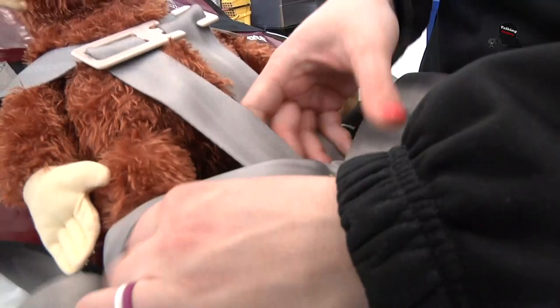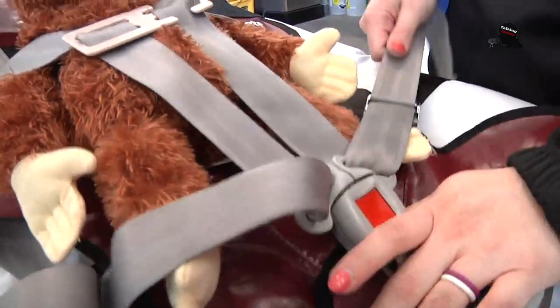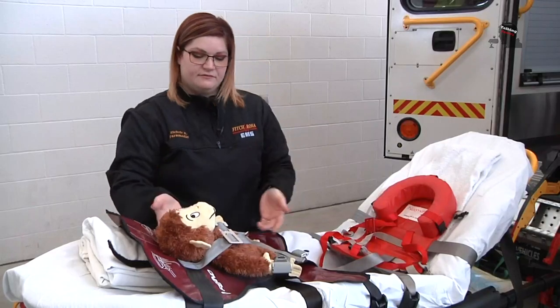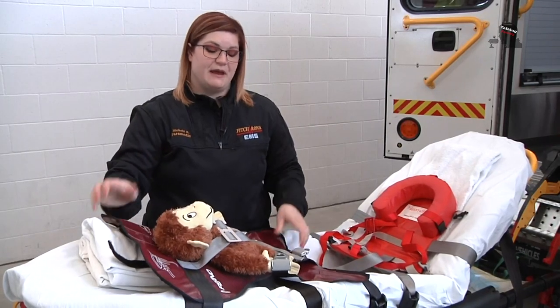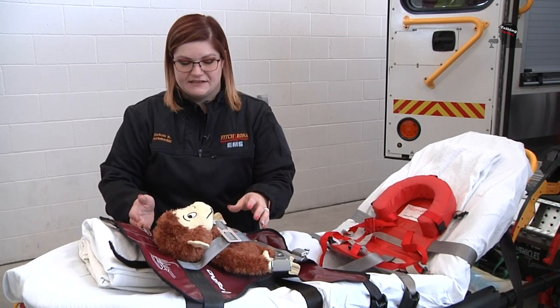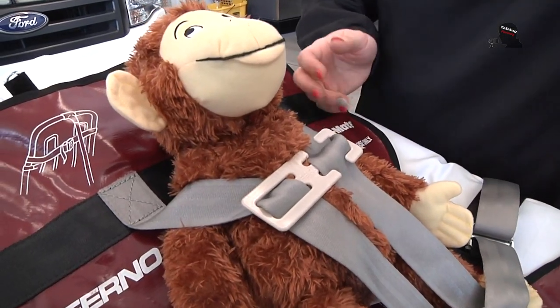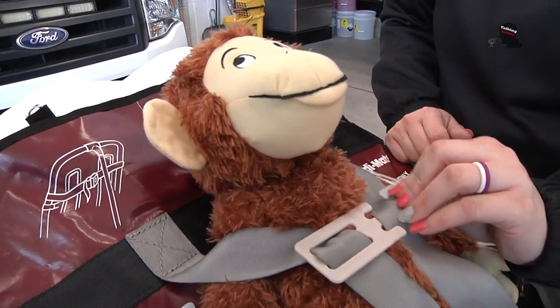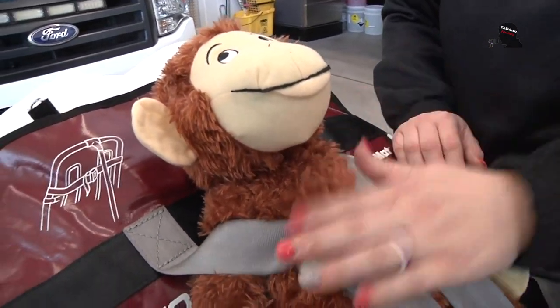And these are also the groin straps. You'd want them pulled nice and tight as well. You don't want to be able to pinch any of this. And again, the child is secured to the cot with a device made for transporting pediatric patients in an ambulance. We still have access to patient's airway, chest for CPR procedures if we needed to, as well as limbs for vital signs, IV things, hand-holding.